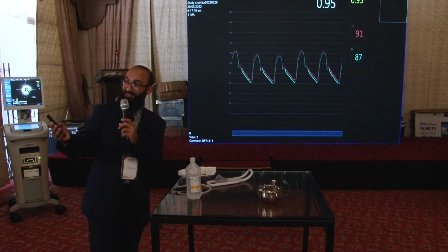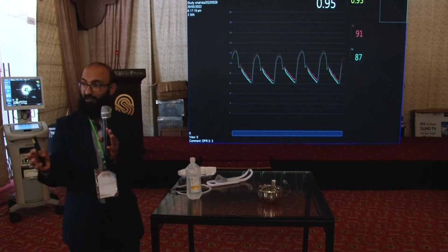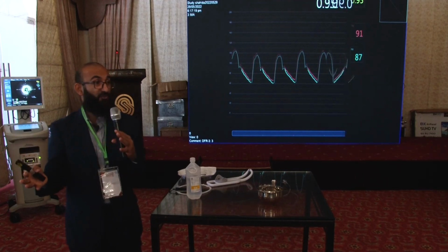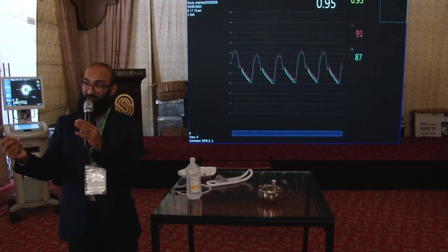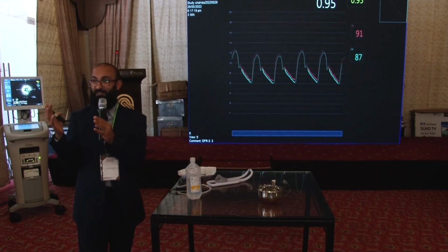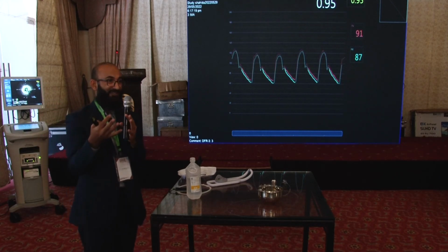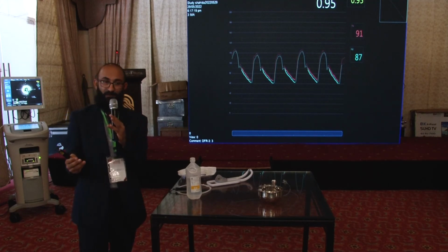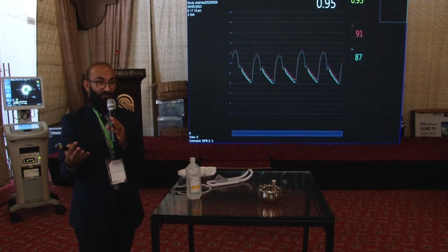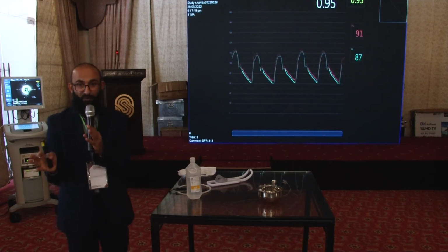And one thing is that in a hospital, we can have a good relation with the industry to bring in these tools. That's very important. And I would say to Boston that the IVUS catheter, the rota, and these things have to be prioritized for a center which is doing high volume, and they have to support others as well. This is how the practice has to evolve, and these are very important tools, honestly speaking.